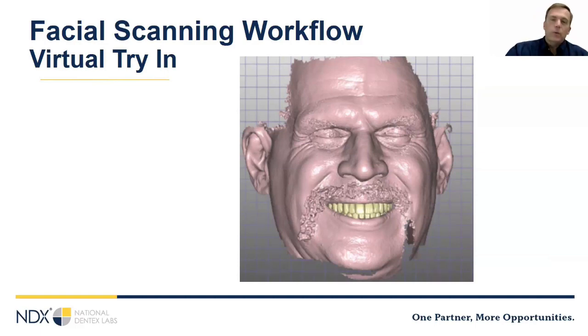And I'm sure when you do the first view, you'll be like, oh, this is kind of sci-fi, I want to actually see something. And of course, your laboratory can get you a try-in, but you'll see pretty quickly that what you saw in this image is exactly what you see with the final. So what this does is it allows you to use a reference denture and do a 2-appointment denture, basically your scan appointment and your delivery appointment.